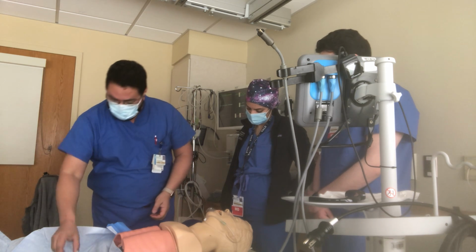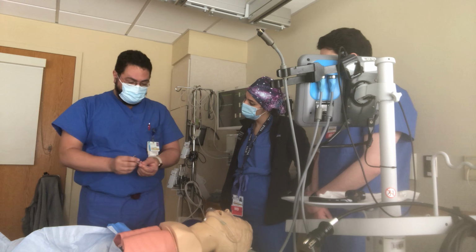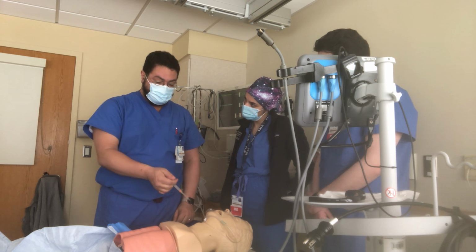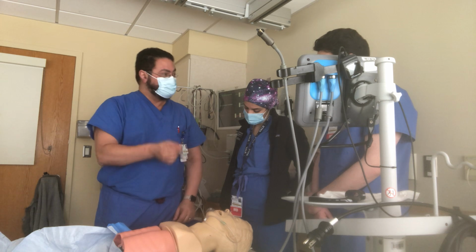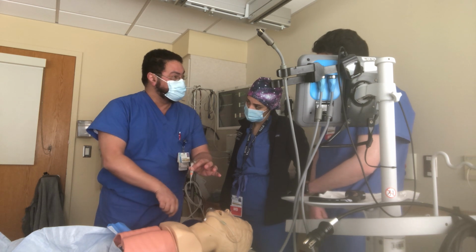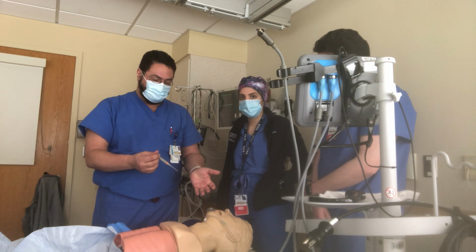And then use this thing called tracheal hook, and literally you are trying to bring the laryngeal mucosa close to the skin. So literally, randomly and blindly, you go inside and fish for something until it hooks on something. Could be the vocal cords, who knows? You just hook up on something, and then you put the tracheal tube, the cric, this way. It doesn't work. This is horrible.